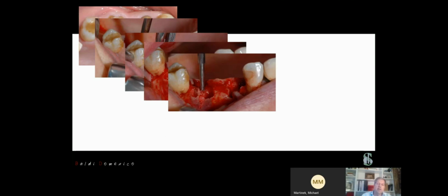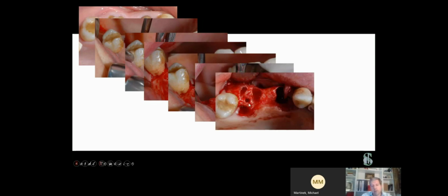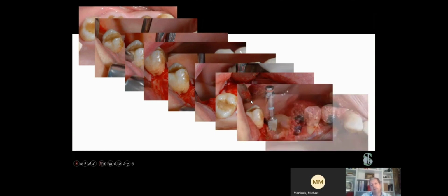After this, we can prepare the new implant site, and so we can finish our preparation. And you can see again how it was possible to maintain this thin cortical bone. We did a perfect extraction, a very atraumatic extraction. And now it's possible to prepare, here in the middle of the root, our new implant site, and then we can place our implant.